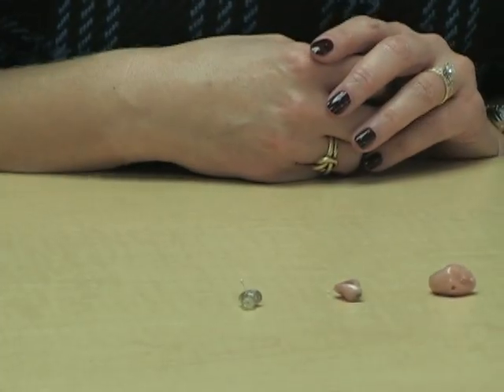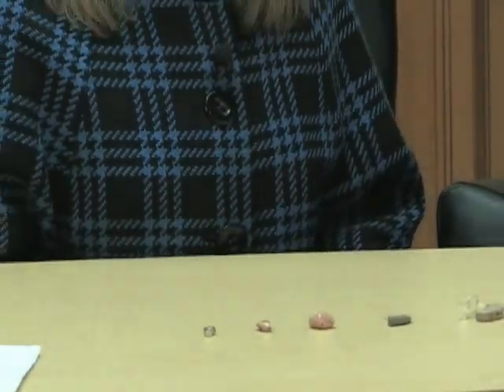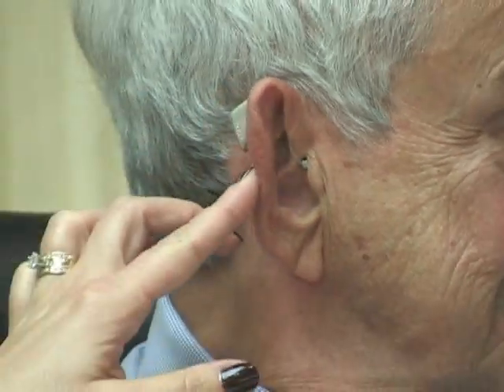We also have a mini BTE with an open fit that Dr. Lippy is actually wearing. Now, I've been wearing it for quite some time now, for this demonstration, and I'm sure none of you have seen it and the camera hasn't seen it. So I'm going to turn to the side, and can you see it now? This has just come out in the recent years, and it's very, very popular. It has just a tiny behind-the-ear device, if you can see that, and a very small cable that goes down inside the ear. And it's very, very lightweight.